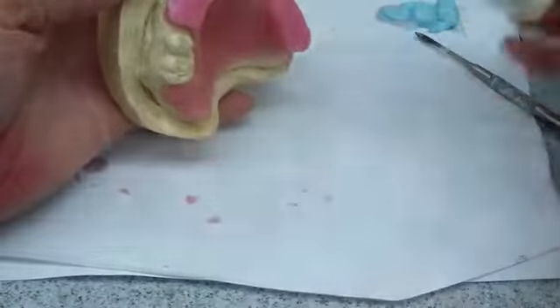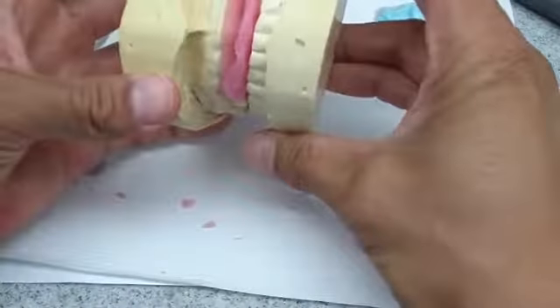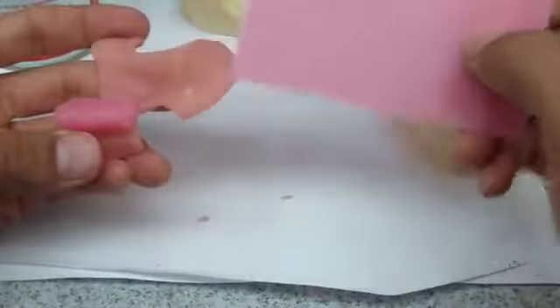We do have, it's actually a cast, that's not really very helpful. We do have tooth-to-tooth contact on his right side and some on his left, so I don't want to put too much wax, but I don't want to put not enough. So what I'm going to do is I'm just going to melt some base plate wax. I've learned you can place sticky wax on there.